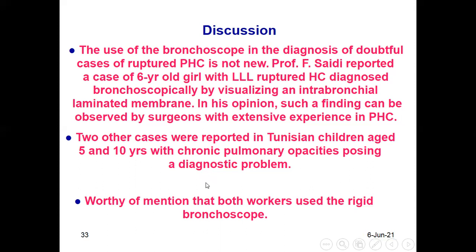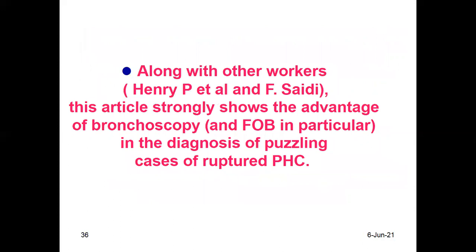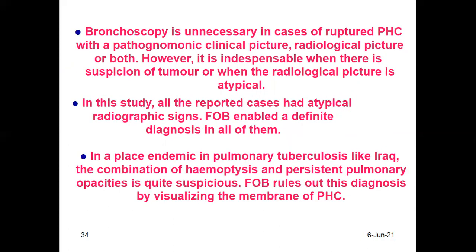It is worthy of mention that both workers used the rigid bronchoscope. Bronchoscopy is actually unnecessary in cases of ruptured pulmonary hydatid cyst with a pathognomonic clinical picture, radiological picture, or both.